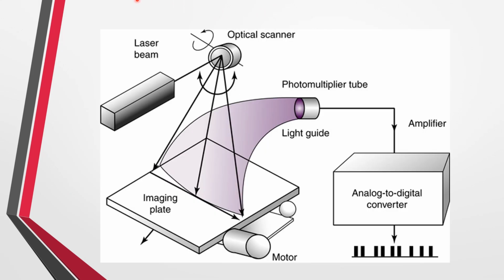We talked about all these components, the mechanical components, optical components, the computer. We also talked about the process so far of stimulate, read, and erase. Let's go ahead and look at it and put it all together in one picture here.